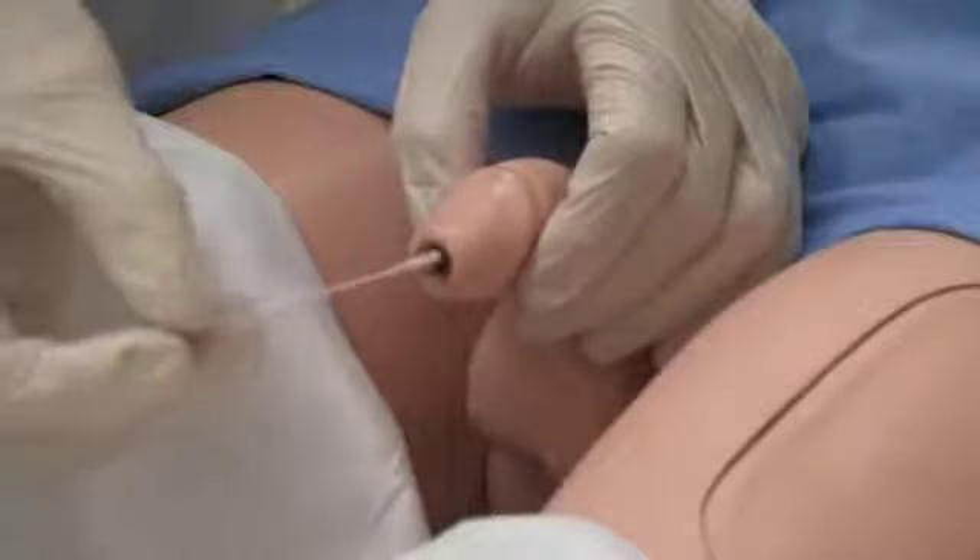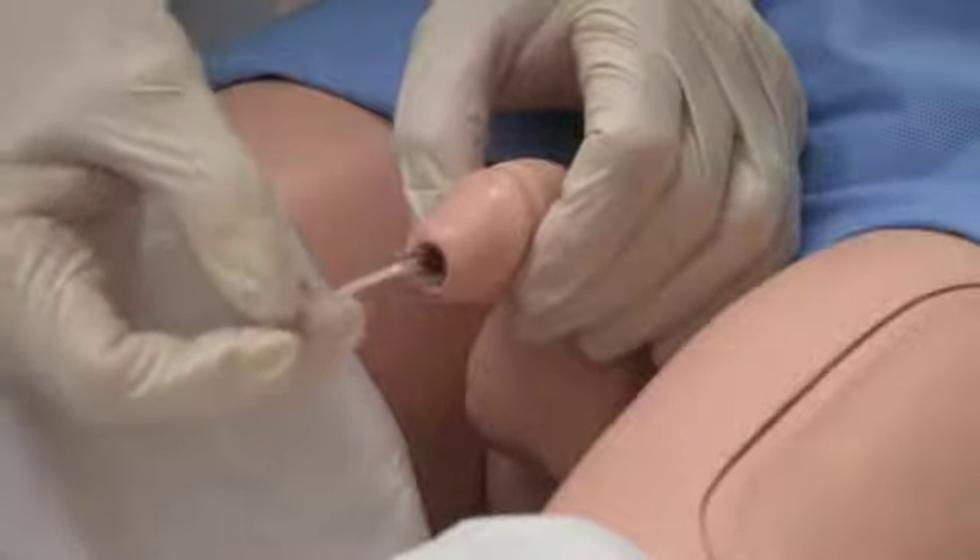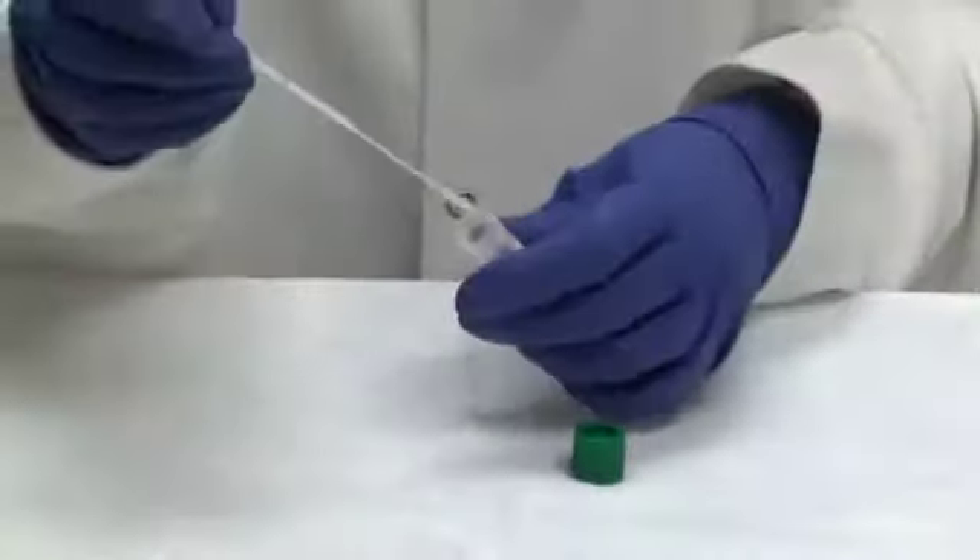If exudate is unavailable, insert the mini-tip swab about 2 centimeters into the urethra. Gently rotate it to collect membrane-associated cells, then remove it. Avoid touching the swab applicator below the molded breakpoint as this could lead to contamination and incorrect results. Inoculate the specimen onto special media as soon as possible and place the specimen in a carbon dioxide atmosphere at 35 degrees centigrade. If it is not possible to inoculate the sample at the point of care, then the sample should be placed into a transport media.